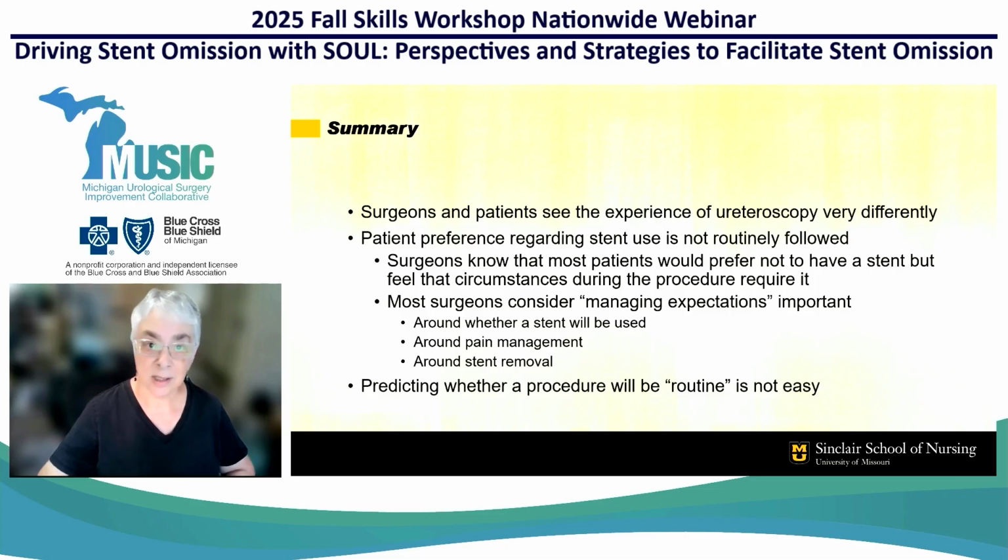So to summarize, this is a very brief overview of what we've been learning from our interviews. Both patients and surgeons see the experience of ureteroscopy very differently. Surgeons focus on the technical issues, and patients focus on the pain that they experience. It is a painful procedure, and they're in pain while they have kidney stones. Most surgeons know that their patients would prefer not to have a stent, but they feel that circumstances during the procedure require it. And most surgeons focus on managing expectations.